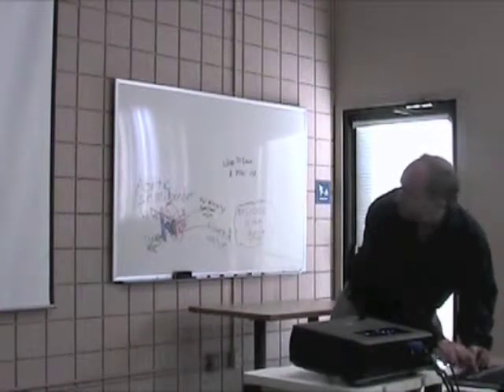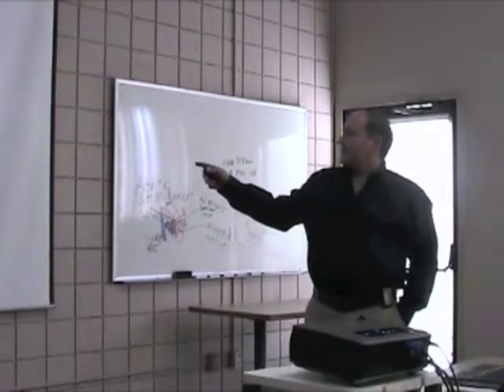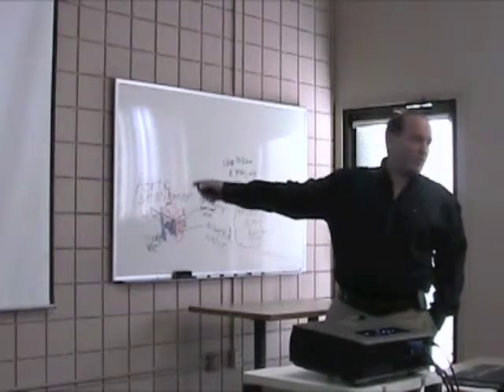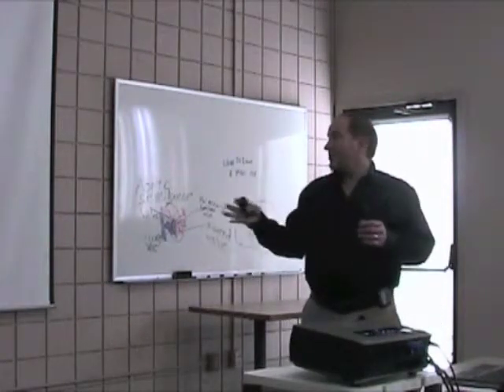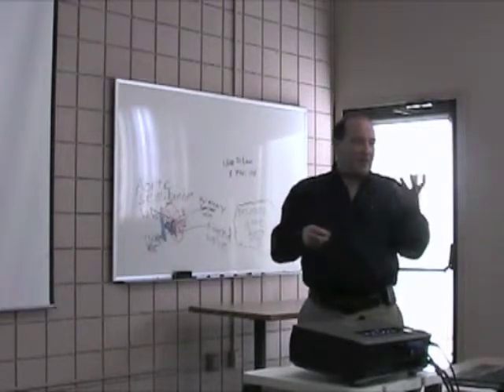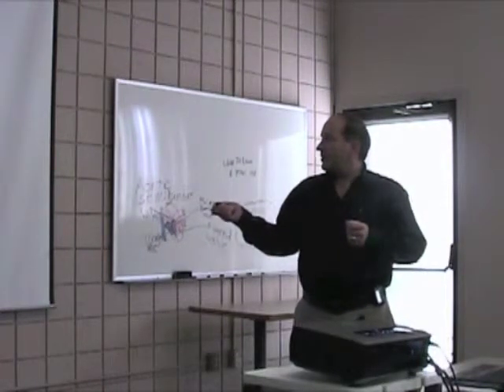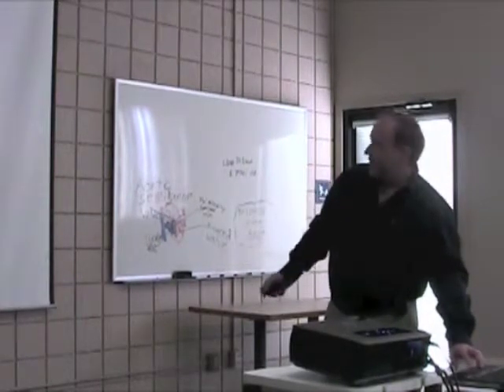I'm going to get this thing to play. So, this is a preparation of an actual human heart. This is a donor heart that wasn't used as a donor, but it was put on a perfusion apparatus at the University of Minnesota where they put non-blood perfusate through there with oxygen through it and allowed the heart to beat. This heart had a mechanical valve in it here as well. And this is just a catheter measuring the pressure there.